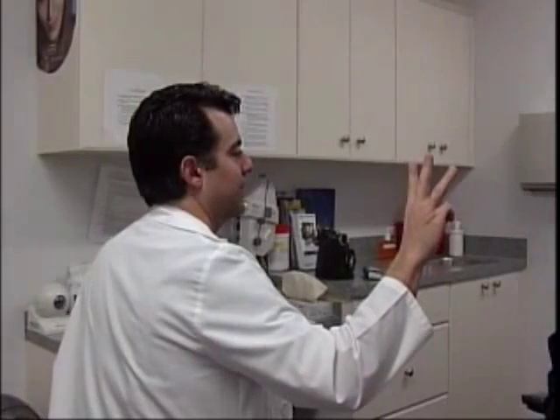We actually are required to look at each of these patients an hour after their surgery just to make sure the implant's in good position and the pressure's good. 4 out of the 6 patients were better than 20/20. 1 was 20/20, and the 6th one was 20/30. So they all had excellent vision immediately after surgery. And all of these are patients who literally can't even count fingers within a few feet in front of their eyes without the surgery and without contacts or glasses. So a very immediate, very dramatic result for these patients.